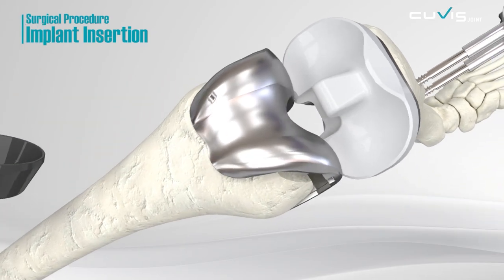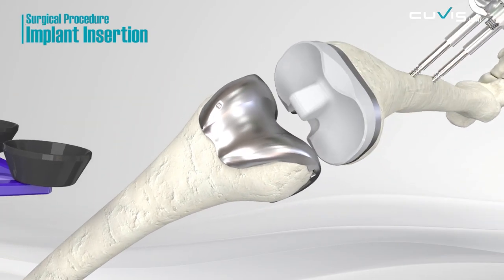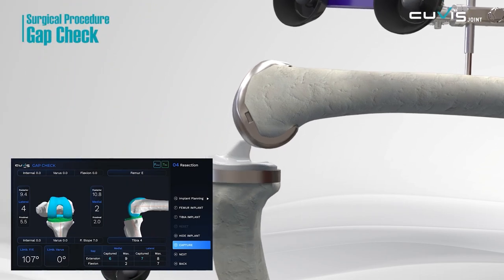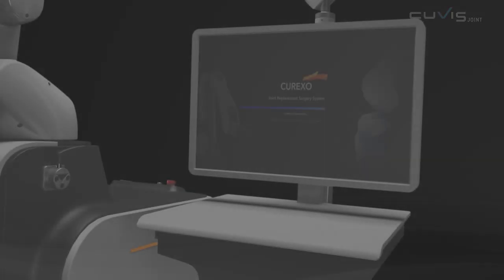Insert the pre-selected implant into the cleanly milled section. After inserting the implant, check the gap of the joints to see the final result of your operation.